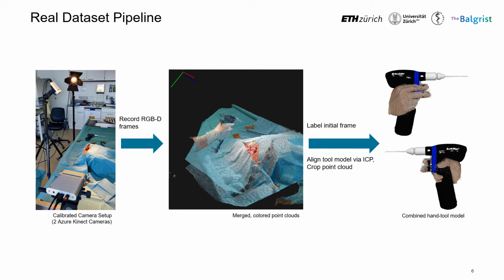As the applied grasp is embedded in this combined model, we hereby assume a rigid connection between hand and tool. This assumption is valid as long as the tool is held firmly.